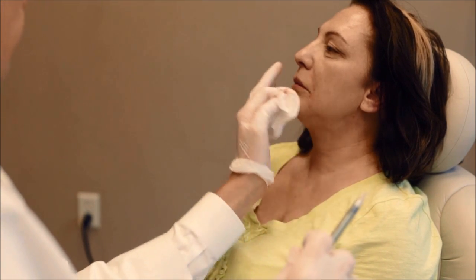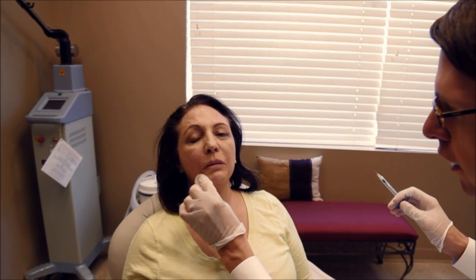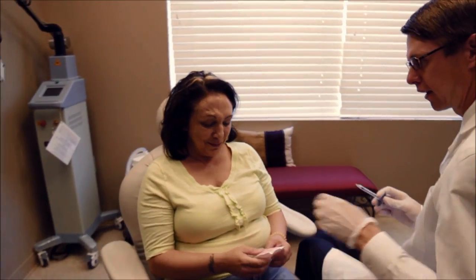Now you can see after this one syringe of filler, which I treated really 4 areas with, her face is just softer around the mouth. She doesn't have those deep lines anymore. These are softer here, and there's no downtime. We'll just have her hold the ice on there, and probably no bruising, I would guess, on this one. And she did great. Minimal pain, right? Totally minimal pain. Yep. Good job. Okay, why don't you get that ice up there?